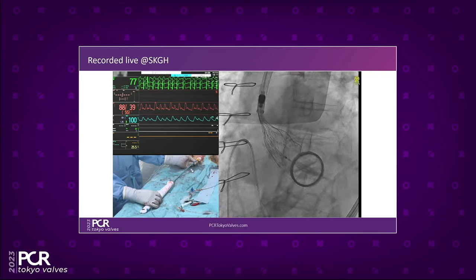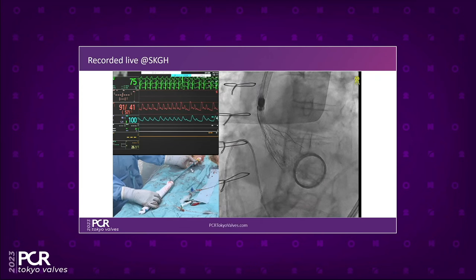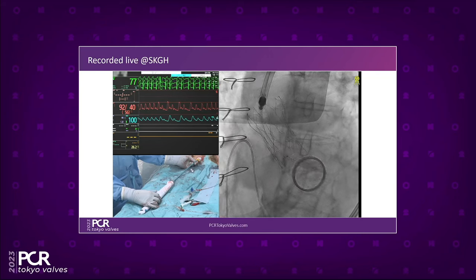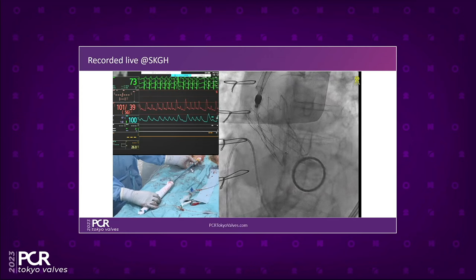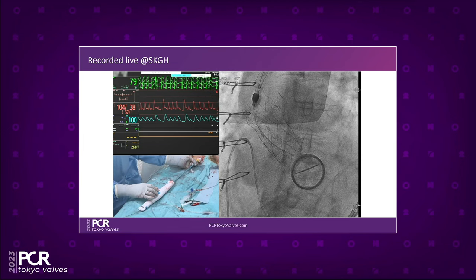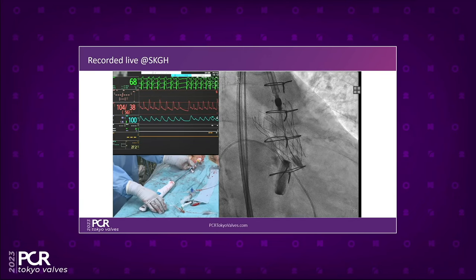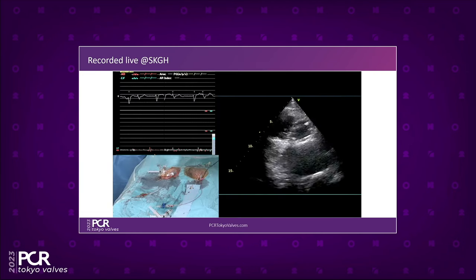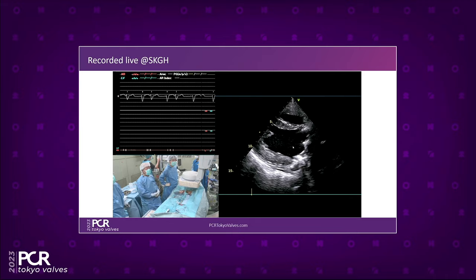So Dr. Saito, which depth is the target of your implantation? Three millimeter. How deep would you like to implant? Yeah, I always adjust the distal marker at the center of the pigtail. And then start. And of course, I'm adjusting the depth while deploying the valve. Also for this particular case, I'm pushing the system because I understood that we did not get good coaxiality for this case. So I pushed the system a little bit and then turned the shaft to the outer curvature.